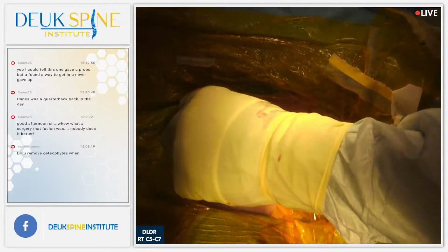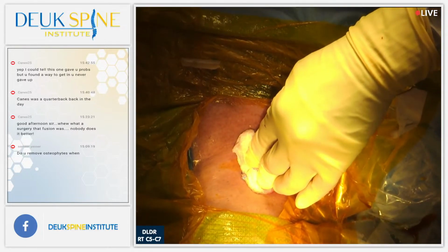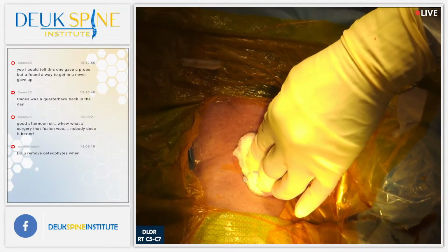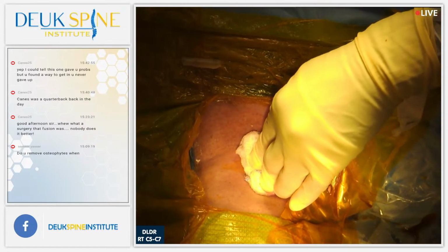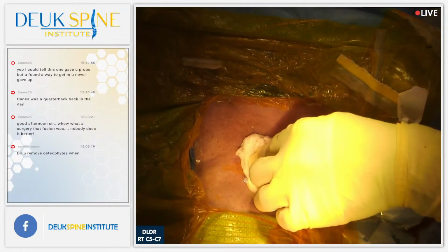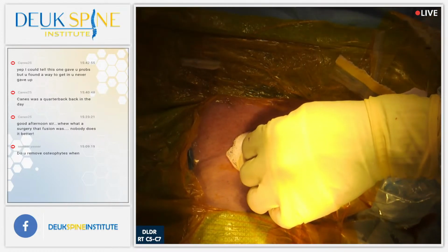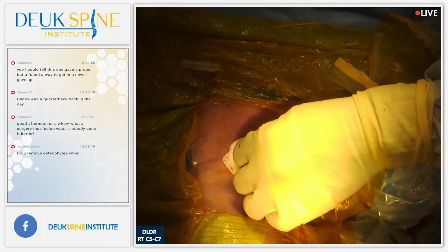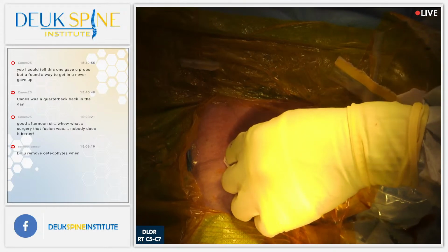Just going to put a little more pressure. I think he must have been on something like ginkgo biloba, or I don't know what he's been on, but he's on something that is making his blood not want to platelet. Yeah, we went through his medication list and everything, didn't find anything, but he must be taking some kind of supplement. I don't know. He'll be fine. Just keep pressure on that for a few more minutes. You got time anyway, Luis, because he's got to reverse him. And then once you get it dry, let's put a bandage with a little bit of pressure. It's very mild. But I think it's going to stop in another minute.